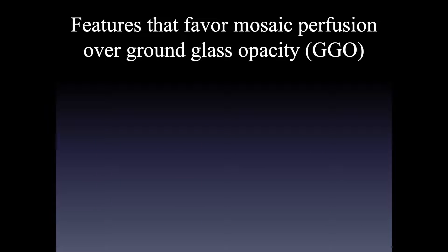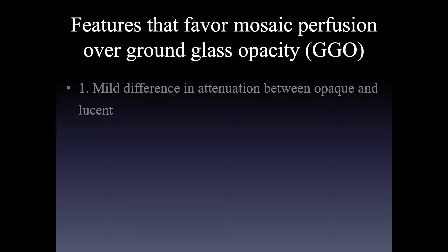How do we make the distinction between mosaic perfusion — lucent lung abnormal — and ground glass opacity? Here are some features that favor mosaic perfusion. None of these are perfect and you'll see exceptions, but these are the rules and they're pretty good, although not perfect.